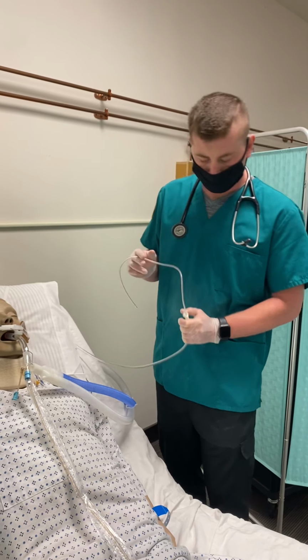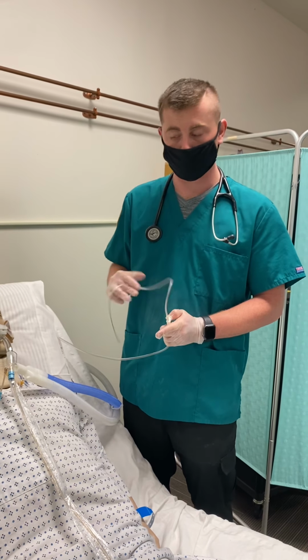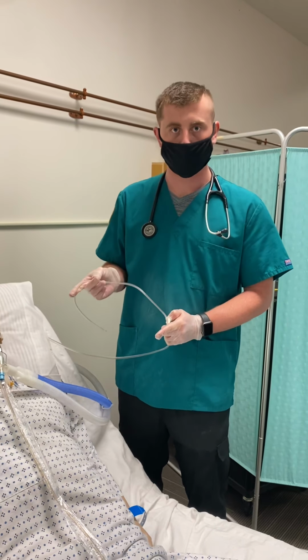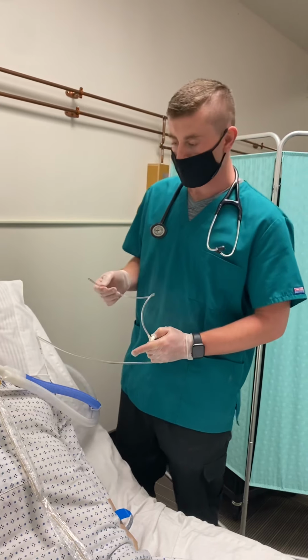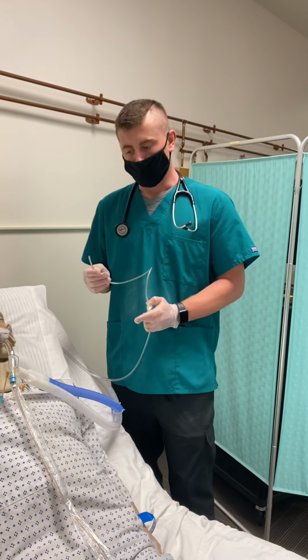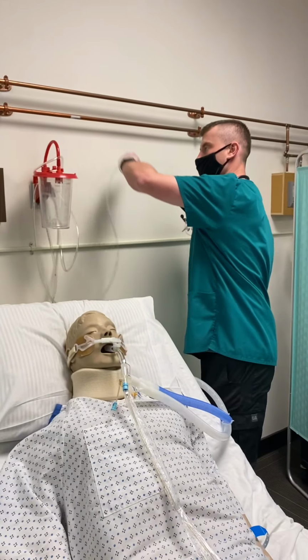After that, if I needed to go through again, I would oxygenate the patient first, especially if the patient's oxygen saturation level was dropping. If not, then I will discard the suction catheter.